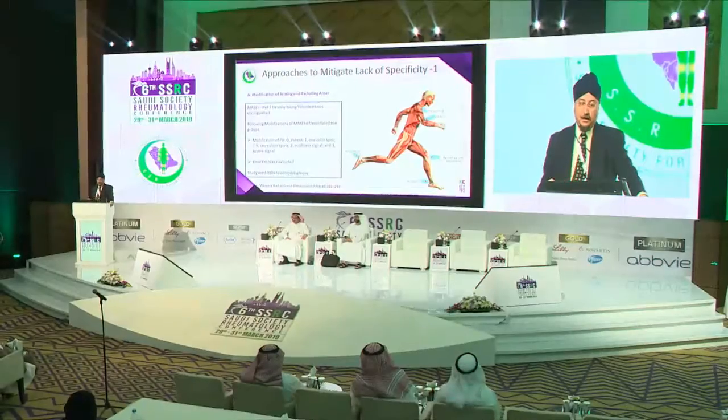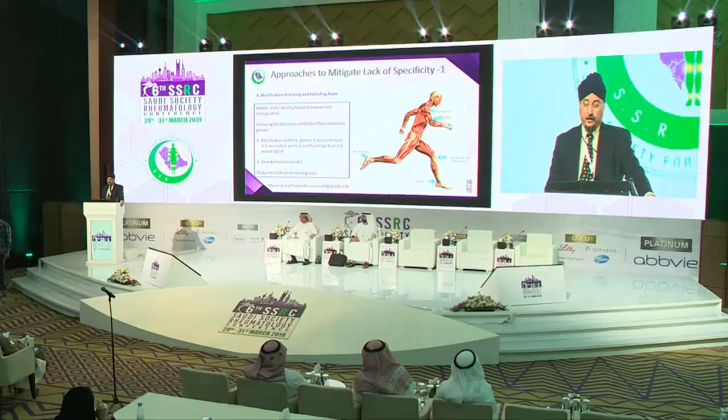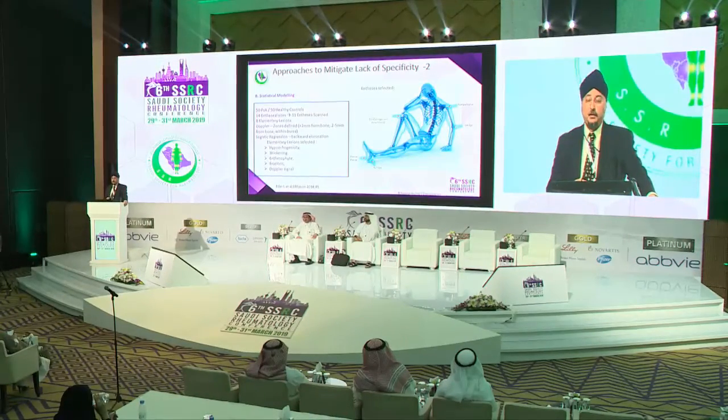This is the second series of studies they have published, and they wanted to figure out how to make sure they could distinguish normal people from psoriatic arthritis patients. So they expanded some of their power Doppler scoring, but that didn't matter as much as taking out the knee completely. When they took out the knee enthesis completely, they were able to compare these groups using the interquartile ranges.